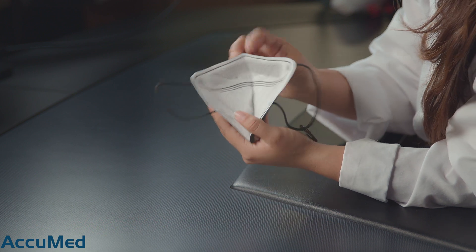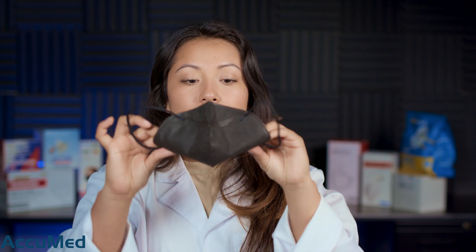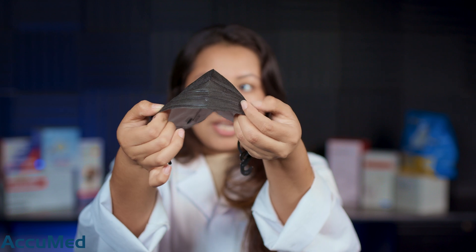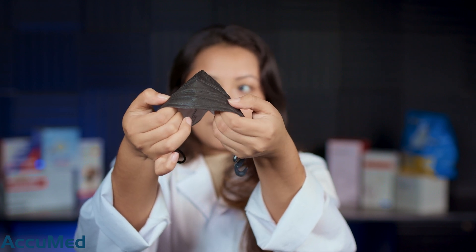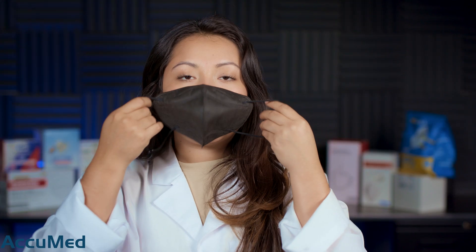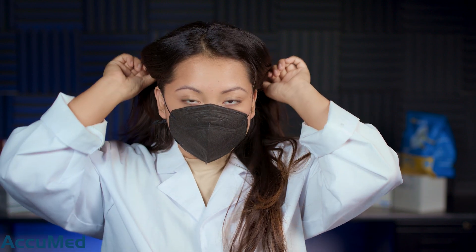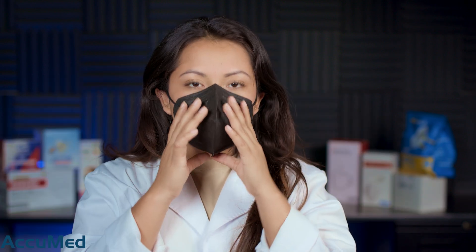Let's go ahead and take a look at the nose wire — it is actually a very strong nose wire, but the only thing I'm noticing is that it's very short compared to the nose foam. The nose foam ends here and the nose wire is here. Let's go ahead and try this on and see how they fit. These ear loops are very tight.